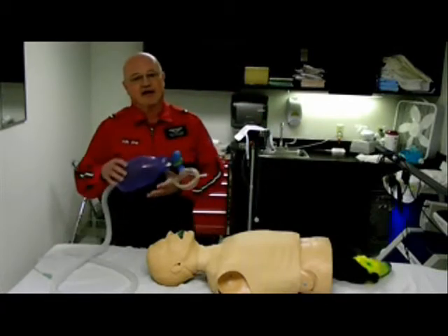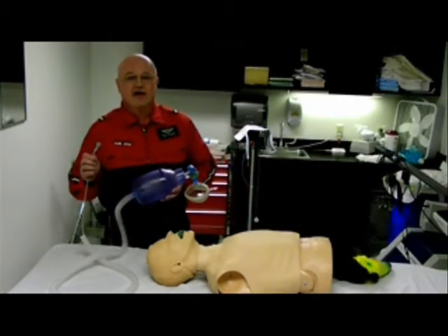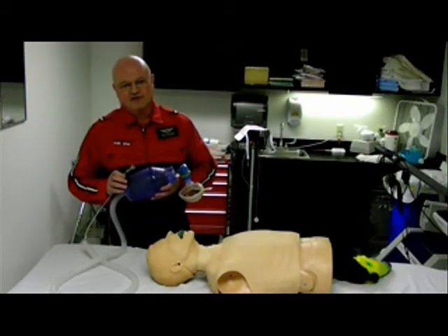We're going to talk about the bag valve mask. First, we want to hook it to oxygen at 15 liters per minute. This will provide 95% oxygen to the patient.